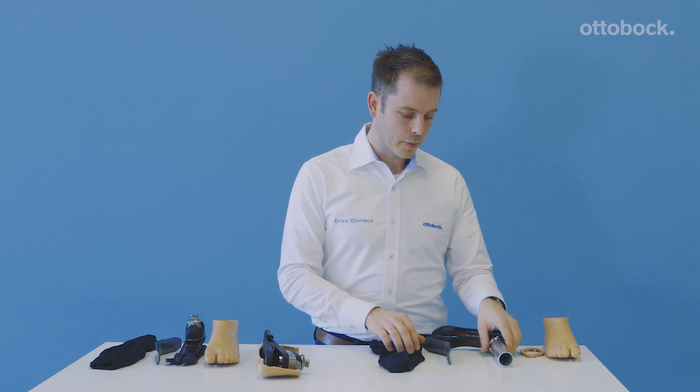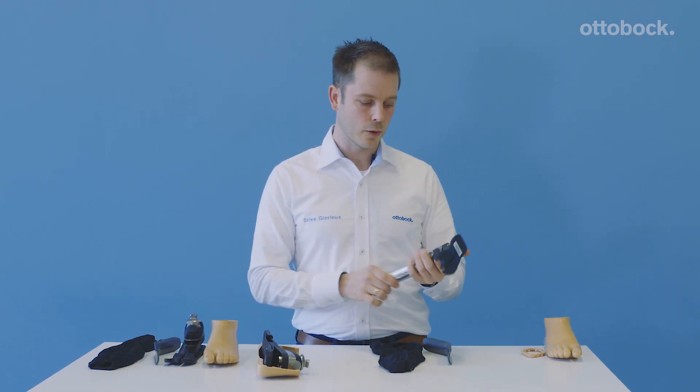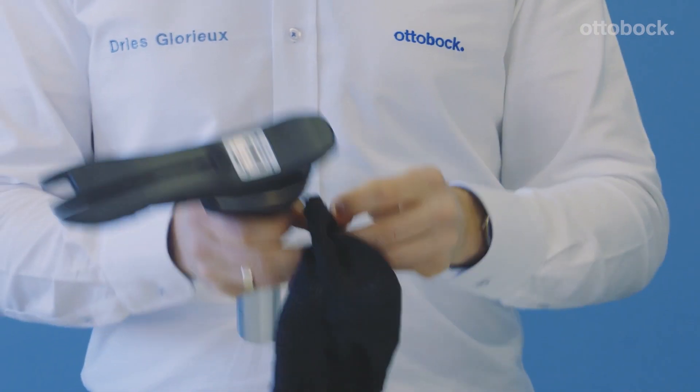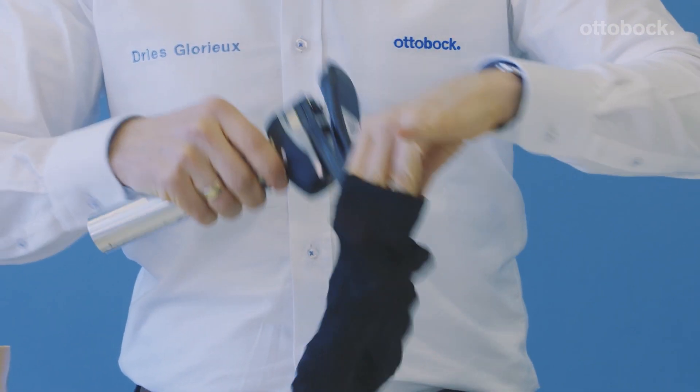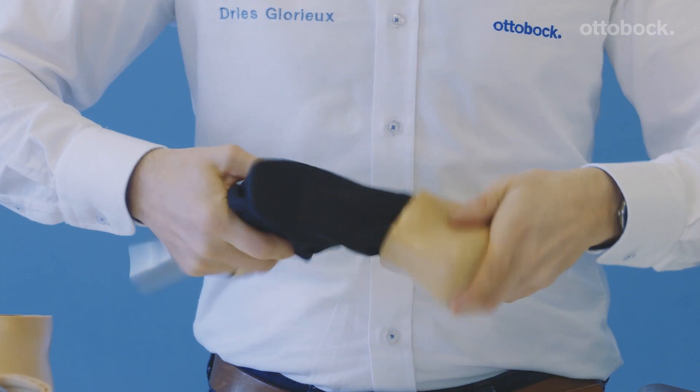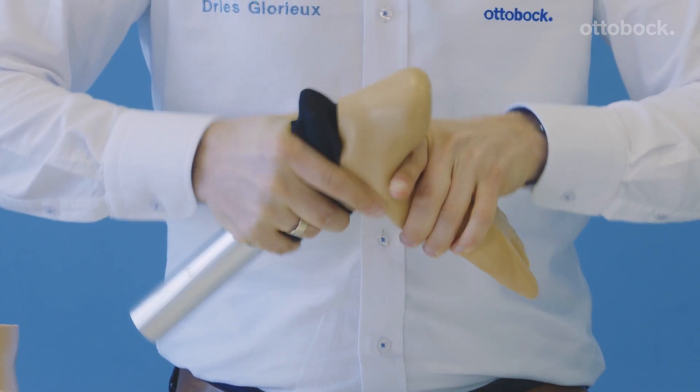Donning the footshell is nothing special — it is quite easy to do, and I will show you some special tricks. I always add a tube on top. Use a spectra sock. Make sure that you take the spectra sock and really pull it high. Then you take the foot and push it as far as possible inside of the footshell.